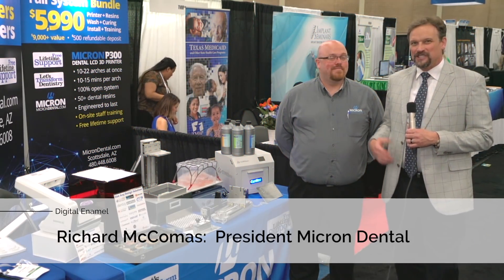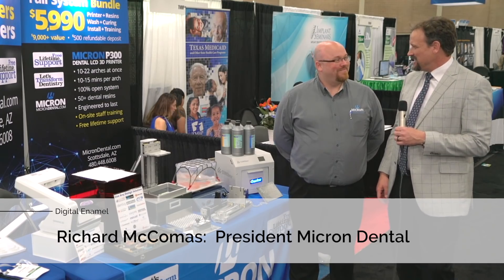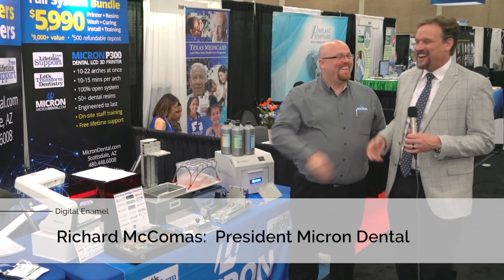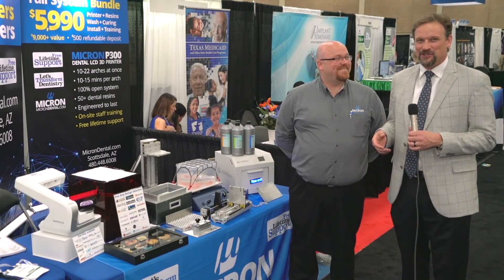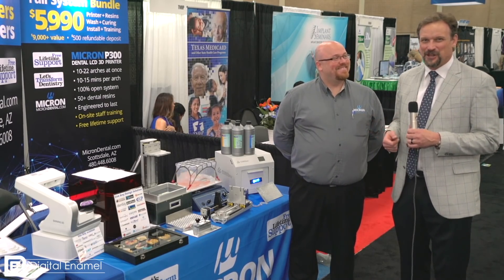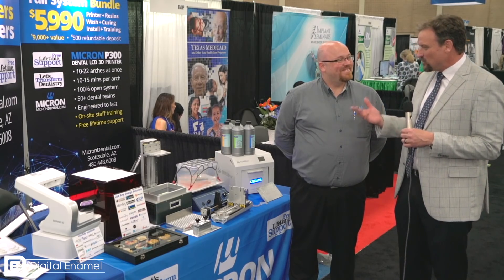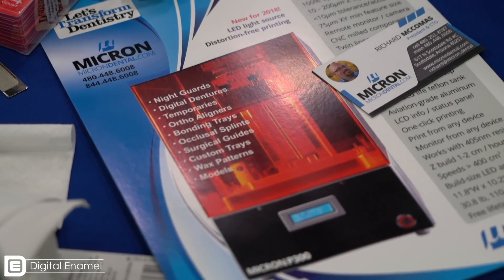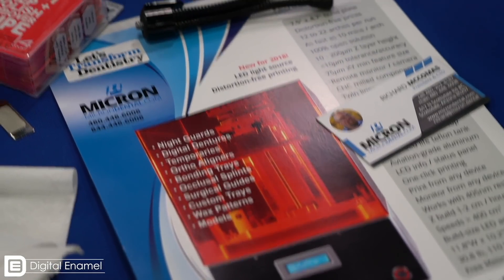I'm Todd Erlich with Digital Enamel. We're at the Texas Dental Association meeting and I'm here with Richard McComas. I just met him. I was walking the booths — I don't normally go talk to printer guys because that's August's job — but I couldn't help resist looking at your printer. You've got an entirely different technology or platform. Tell me all about that.